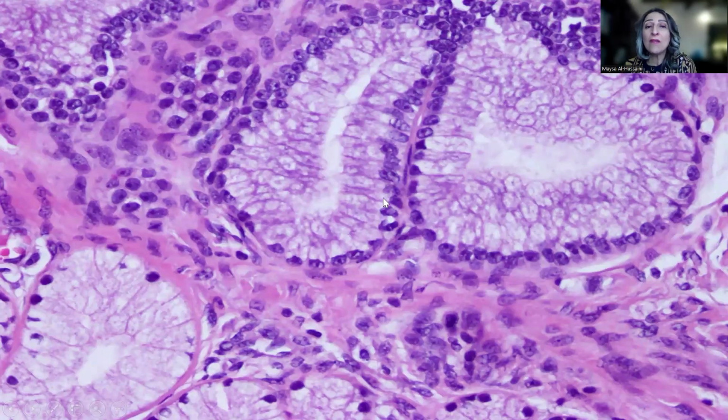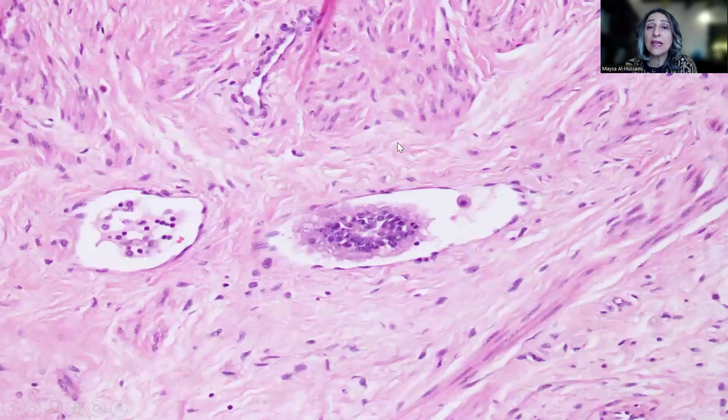And here we have a contrast between both components. The first component I shared with you has a very small nucleus that is basally located, voluminous cytoplasm, and well-defined cytoplasmic borders, and then here we have more pleomorphic nuclei, still basally located, with prominent nucleoli, but we still have this voluminous amount of cytoplasm. And please note that in general, there is a lack of mitosis and apoptosis.